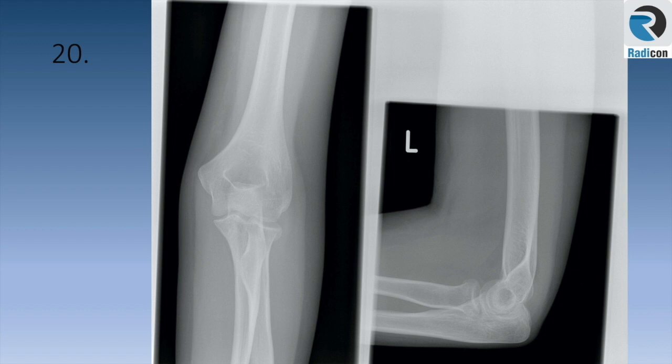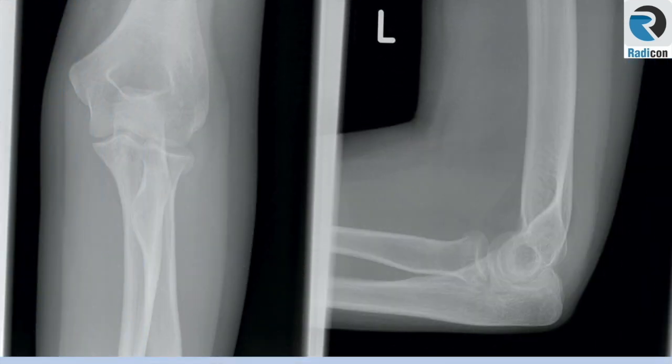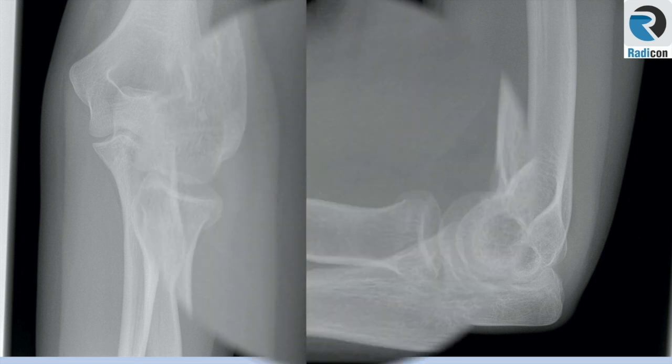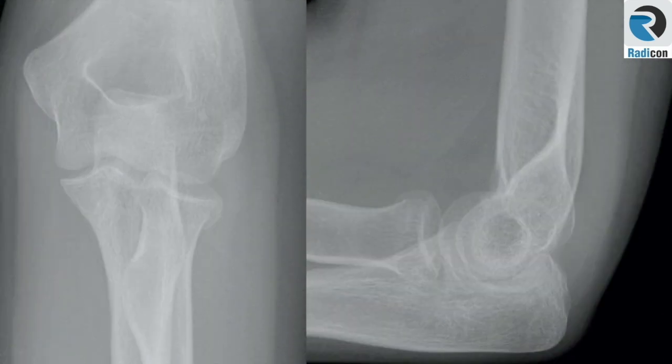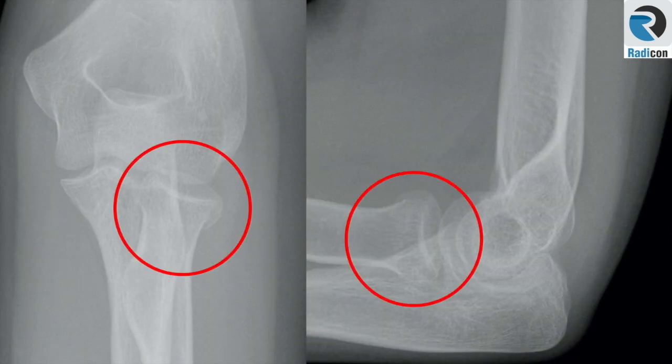Case 20: AP and lateral views of left elbow. On zooming, there is joint effusion present with prominent displaced anterior and posterior fat pads. This suggests expansion of the joint capsule due to haemarthrosis and a fracture. Radial head fractures can be very subtle and you may have to use maximum zoom. These may be seen on AP or lateral views.